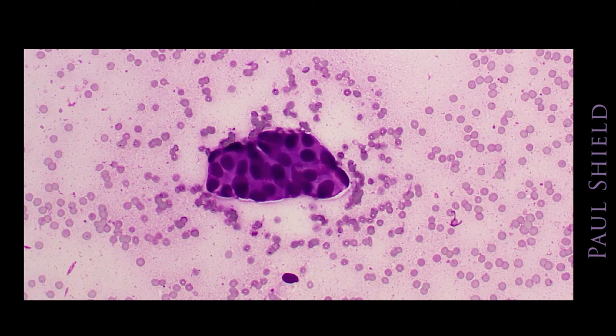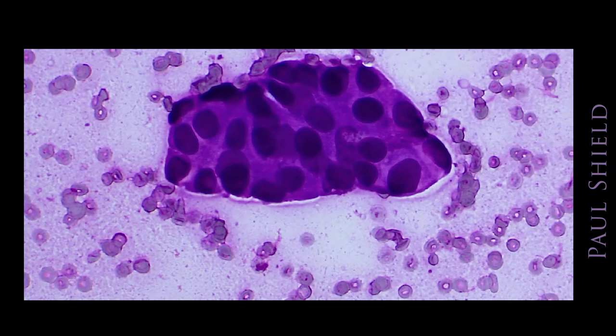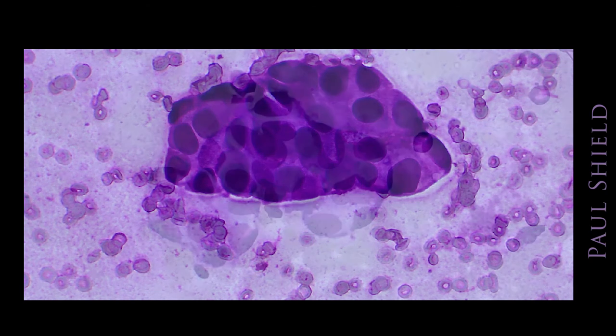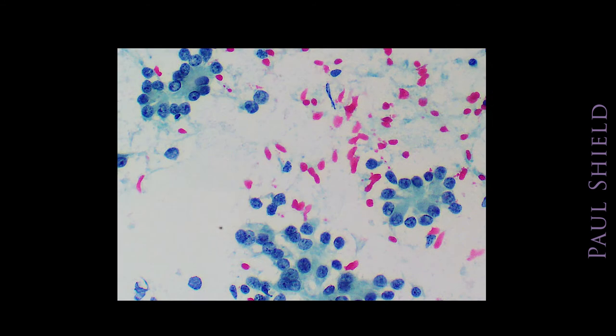This is a classic glandular arrangement in a Diff-Quik stain slide. See how the nuclei are pretty much arranged around the outside of this group, and it has a scalloped but fairly smooth community border. This one is much the same. In fact, even a better example. You can see the columnar shape to the cells with the nucleus out on the edge. And these are classic rosettes or microacini that are typical of adenocarcinoma.